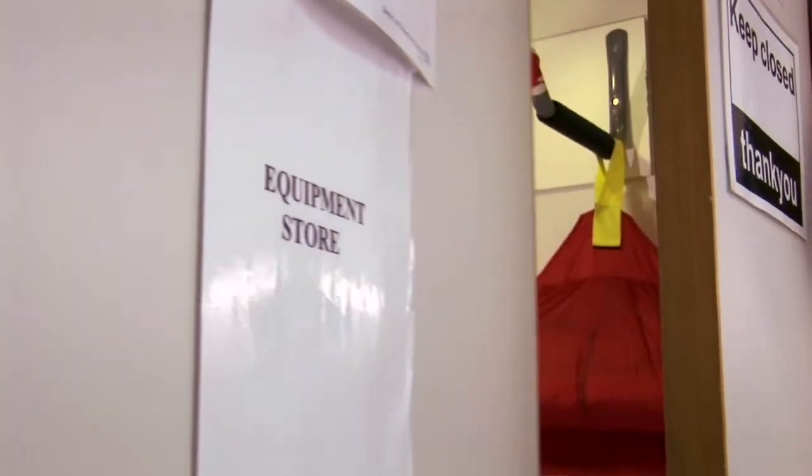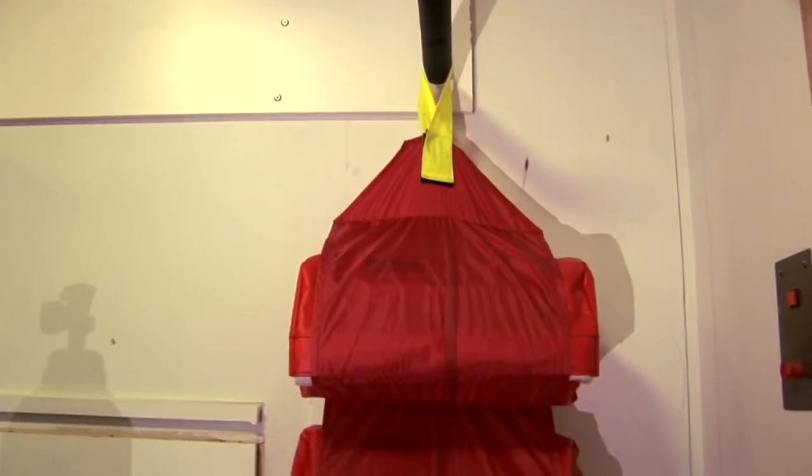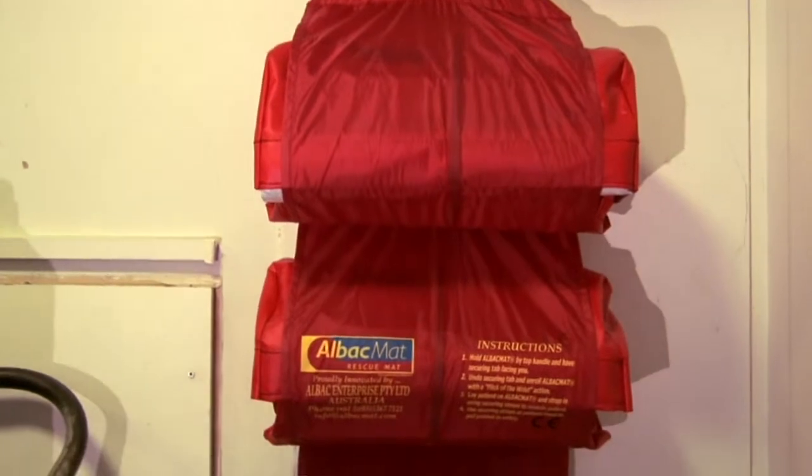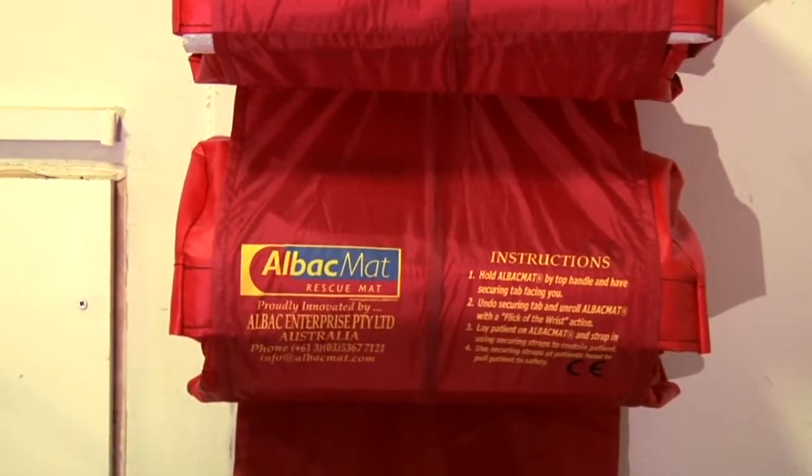ALBAC mats will be made available in wards and departments where a need has been identified by assessment. You must familiarise yourself with the location so you can find them in an emergency.